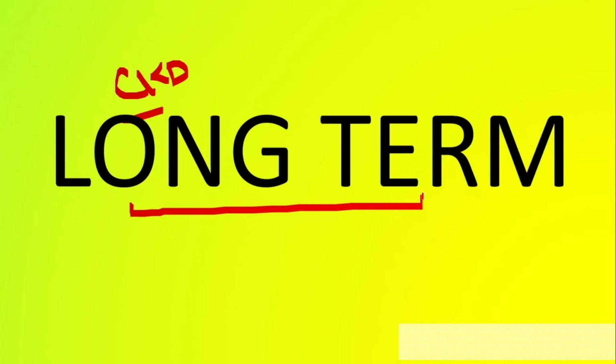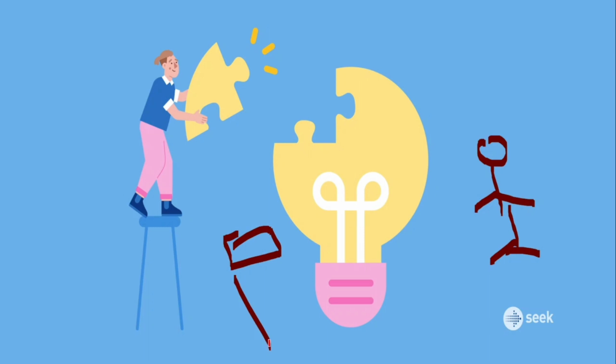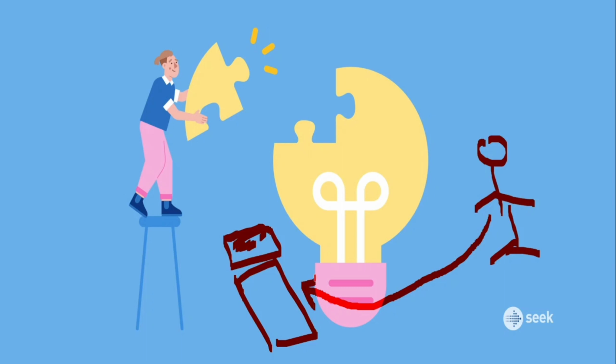So how to take the blood from the patient to the machine over a long period? What is the problem? Between the patient and the machine or the dialyzer, because in the beginning the machines were of different dimensions, let us just take the current machine. The blood has to come from the patient to the dialyzer at a particular speed, or the blood has to be pumped out.